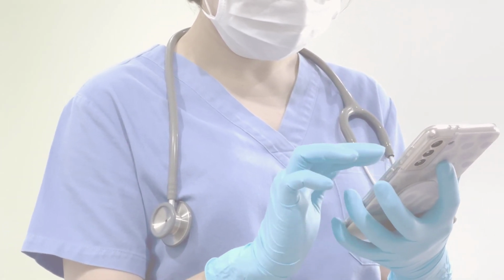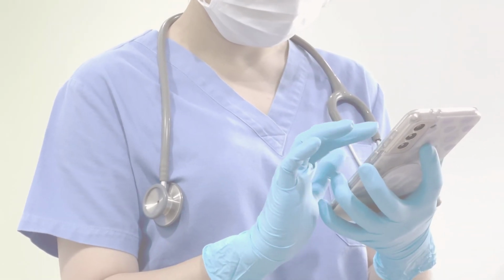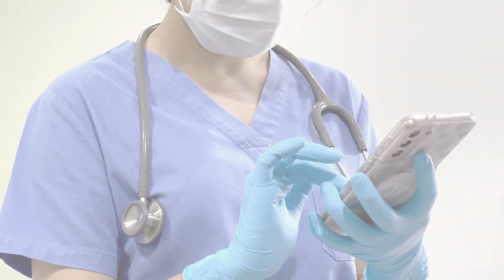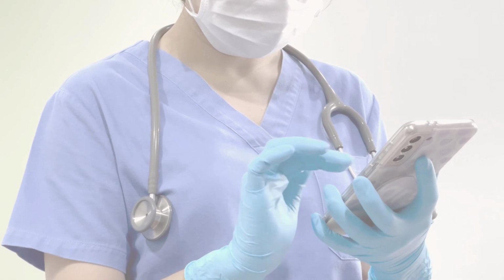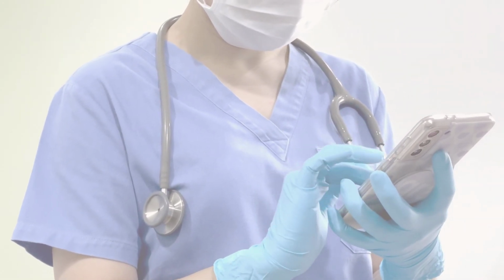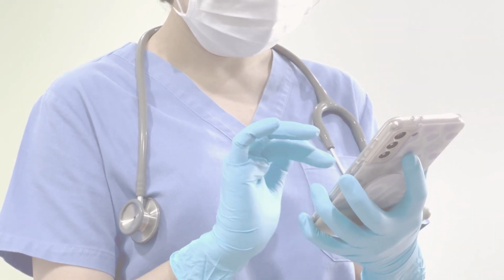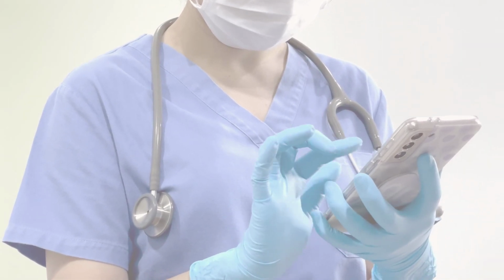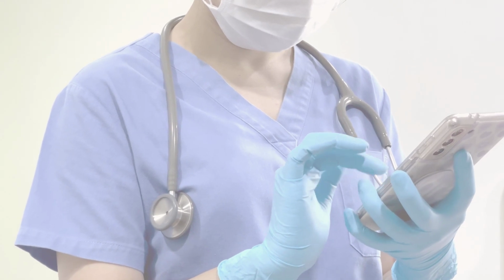After the surgery, you'll have a new opening in your body called a stoma. Your waste will pass through this opening into a small bag, also called a pouch, that's attached to the outside of your body. You'll need to empty the bag into the toilet a few times each day. It might feel strange and overwhelming to have to do this, but you're not alone. Many people have ostomy surgery, not just because of GIST, but for other reasons too. It's important to learn how to care for your body properly to avoid skin irritation, infections, and leaks.